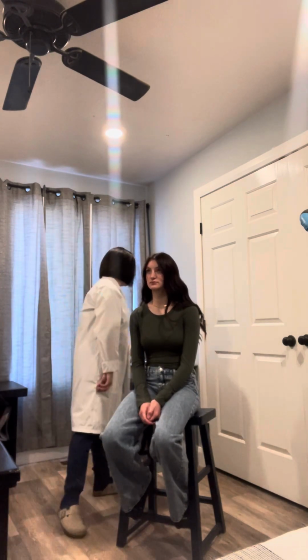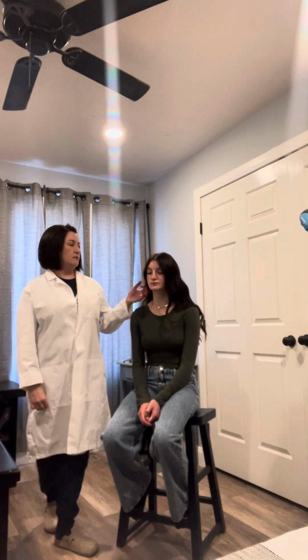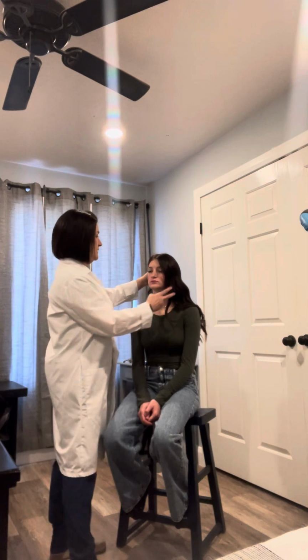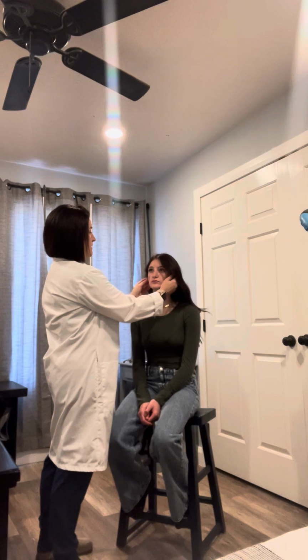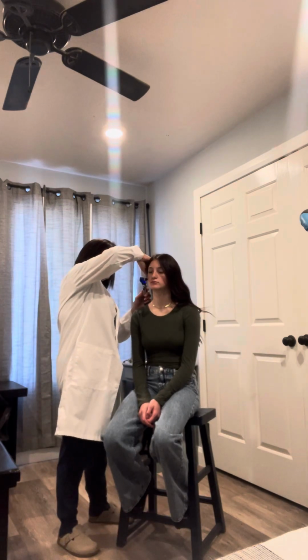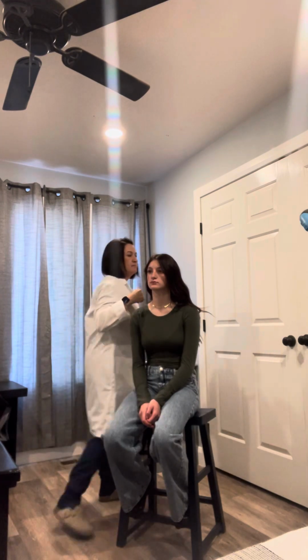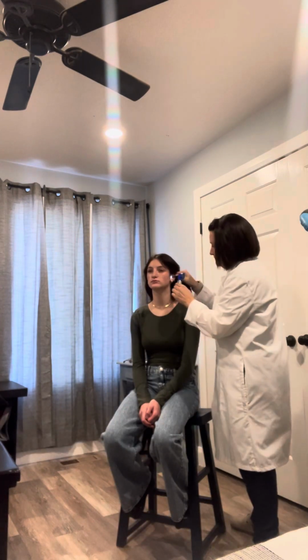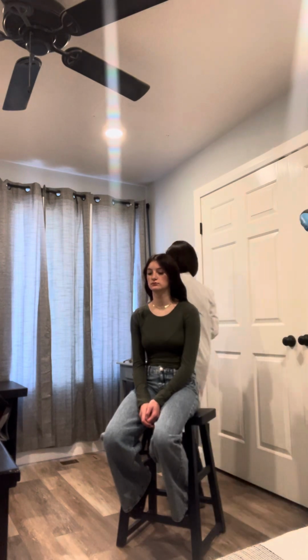Since I skipped ears, we're going to go back to ears. First, I'm going to look again at the symmetry and the size. I'm going to palpate both the pinna and the tragus for any masses or nodules. I'm going to inspect the tympanic membranes with my otoscope. That one's pearly gray. And that one's also pearly gray.